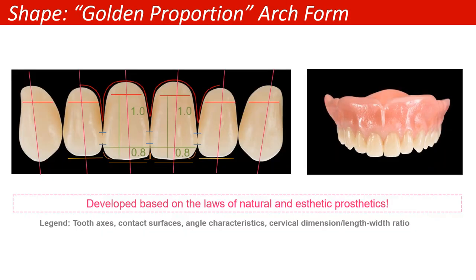So we take those proportions, we broaden them out. Are they good proportions? Have we broadened out the contact area? We've kind of elongated the contact areas, make it more natural. They're not pinpoint. They have a facet, a negative and a positive link to them, a facet that they kind of line up. And when you set them, they line up perfectly. They kind of self-align, which I'll show you a movie later on to see that.